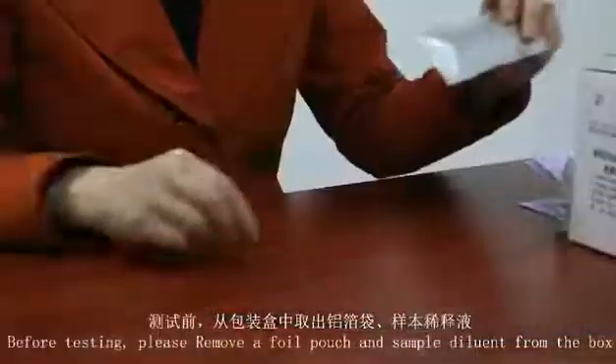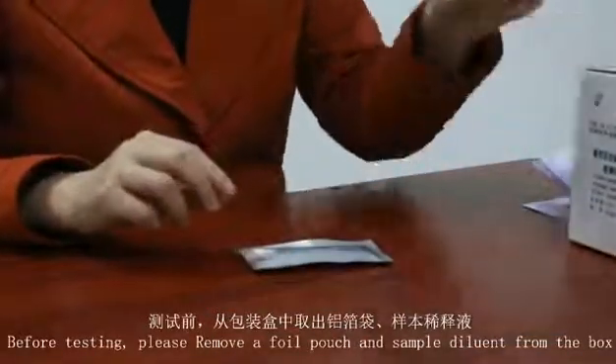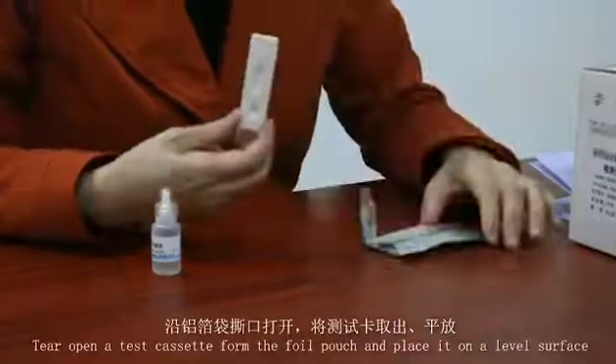Before testing, please remove a foil pouch and sample diluent from the box. Tear open a test cassette from the foil pouch and place it on a level surface.